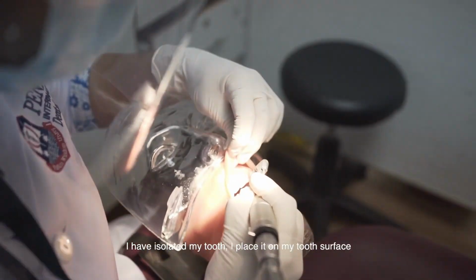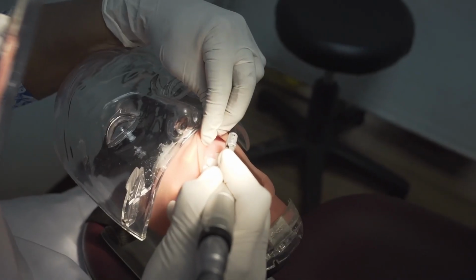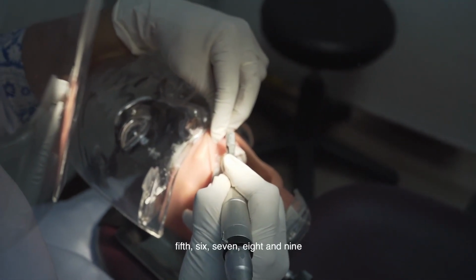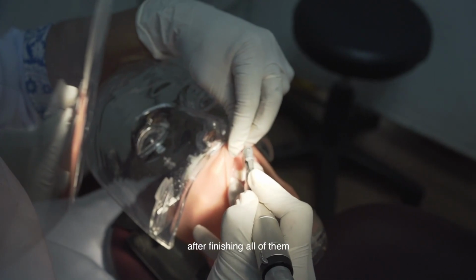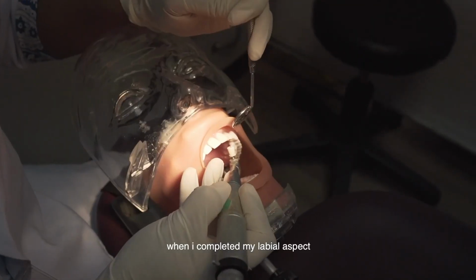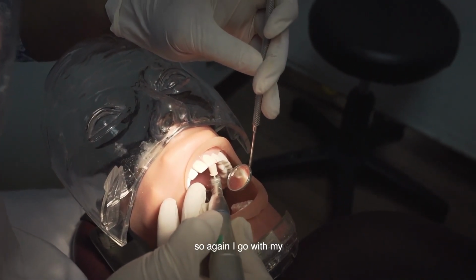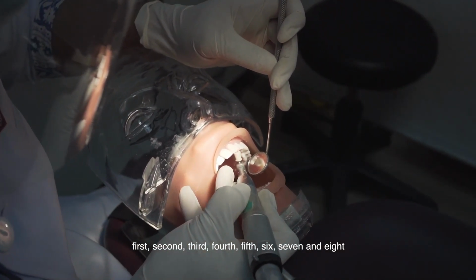I have isolated my tooth. I place it on my tooth surface, and then I go in for my first quadrant, my second quadrant, my third quadrant, my fourth quadrant, fifth, sixth, seventh, eighth and ninth. After finishing all of them, one single full circle. When I have completed my labial aspect, I go on with my lingual aspect. So again I go with my first, second, third, fourth, fifth, sixth, seventh and eighth, and one full.